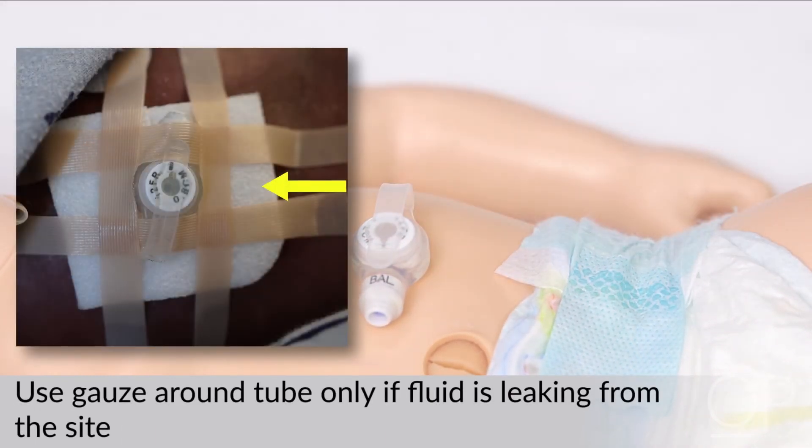Use a gauze pad or absorbent dressing around the tube only if there is fluid leaking out and irritating the skin. Change the dressing at least daily, or more often if it gets wet.